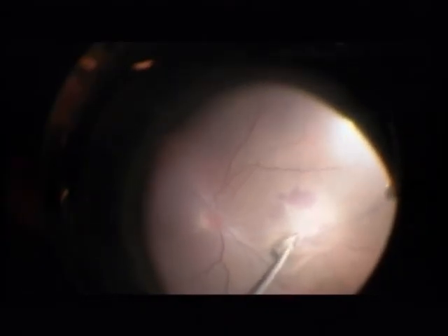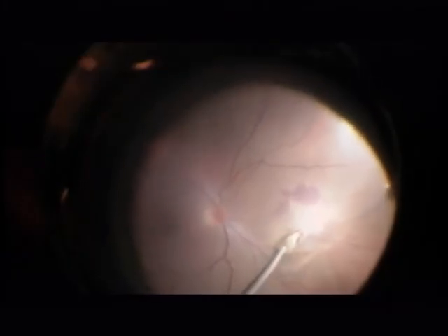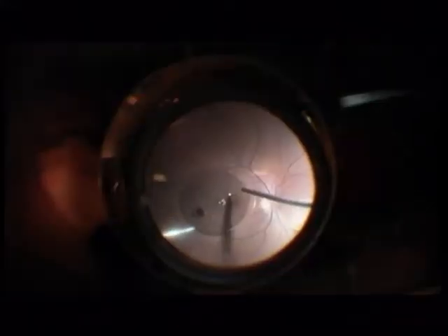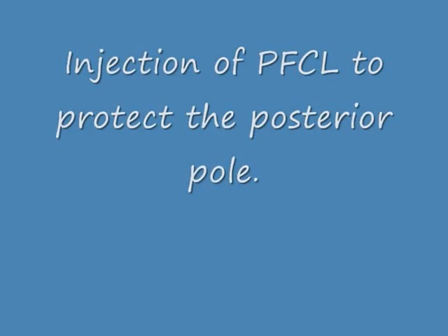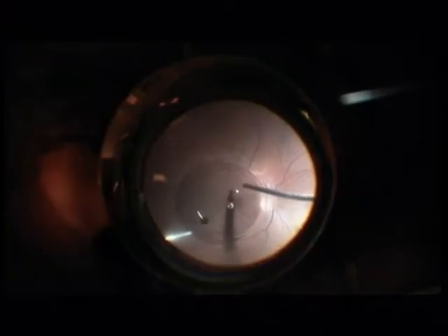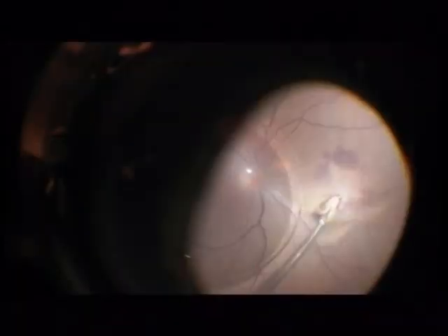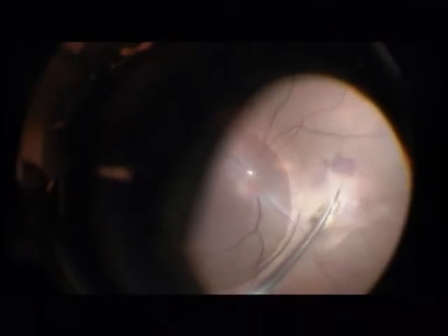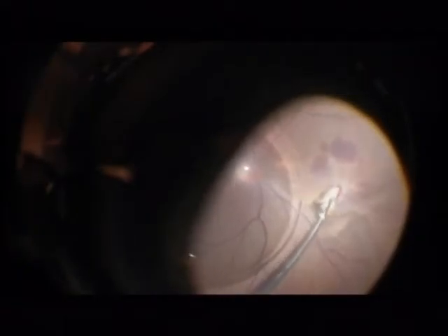Now we come to this intraocular foreign body. You can see that the biggest part is subretinal. I am injecting perfluorocarbon to protect the posterior pole. Now I am using an Atkinson cannula — a really cheap cannula — to open up the tissue above the metal foreign body.